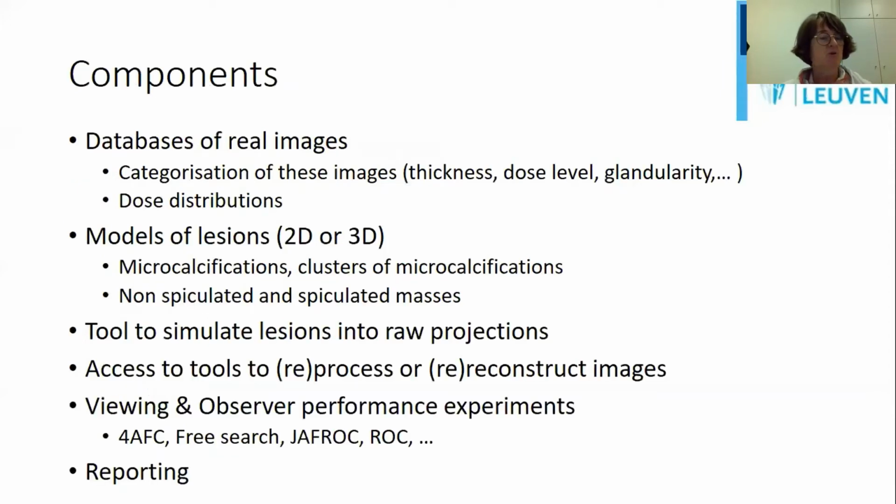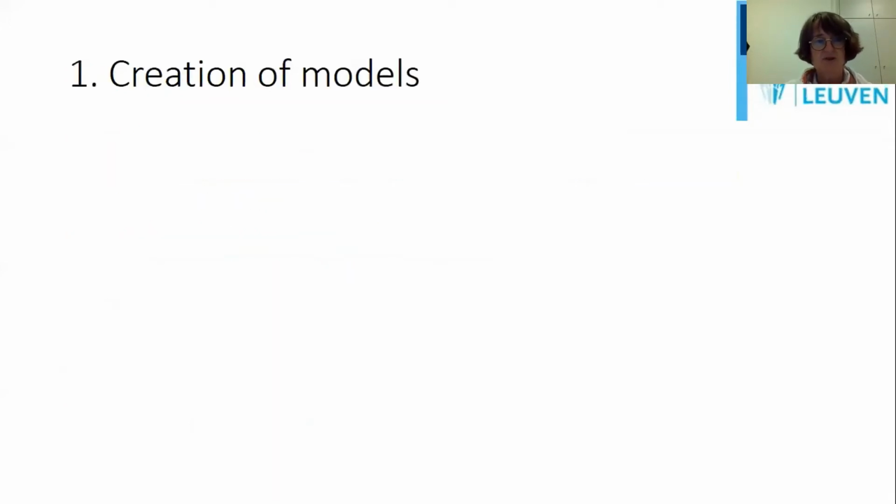There are therefore several components. You need a database of images, you need models of lesions, you need a tool to simulate the lesion in the raw projection, and then to reconstruct your projection into a 2D image or tomosynthesis reconstruction. And then you need something to view your images, and an observer to look at these images and to score these images. And some insight and some experience with statistics is, of course, a big advantage. And then you report, and maybe I should have added here webinar. If everything is fine, then you may be lucky to get the invitation for a webinar.